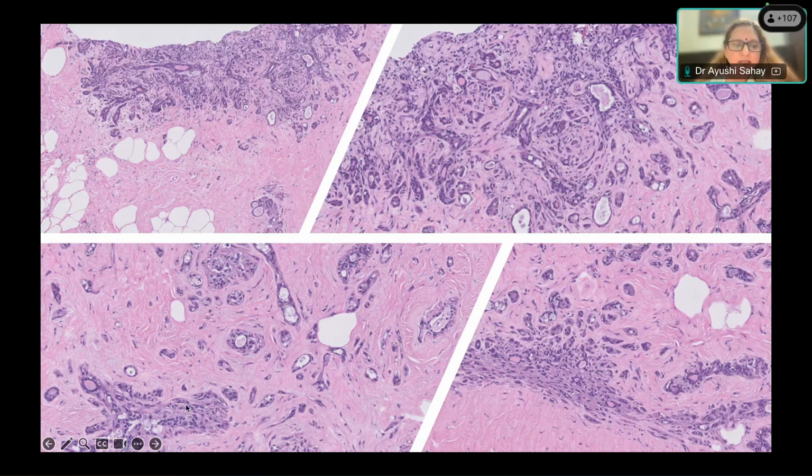This again you can see larger duct and smaller branching ducts. So you are having kind of a TDLU, terminal ductulo-lobular type of arrangement. Though it is looking very compressed, very elongated, very angulated, what you thought is desmoplastic looks like it could be a pink myoid appearance. Otherwise, it still has lobulocentricity, appearing limited to a lobule with a larger duct branching into smaller ducts. Now these smaller duct branches seem to be getting pinched out from the larger duct. Very small pinched out appearance of the ducts is there.